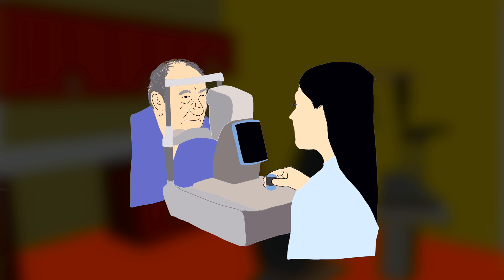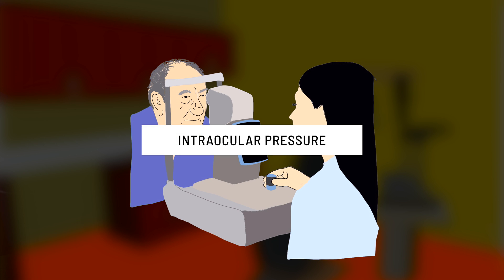In the case of puffing air into people's eyes, we are looking at the intraocular pressure, which is just a fancy term for pressure inside the eye.